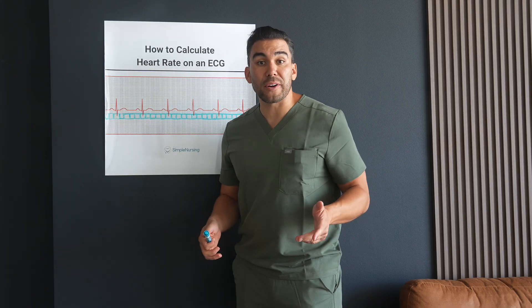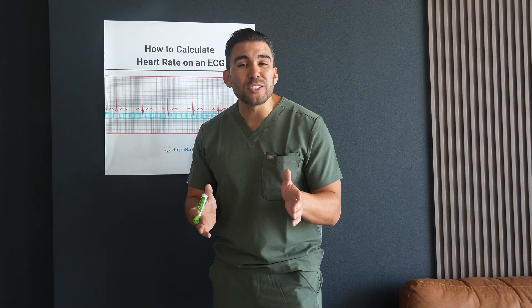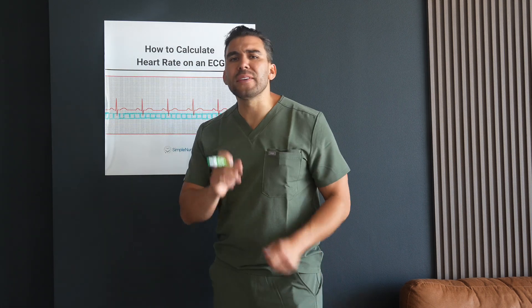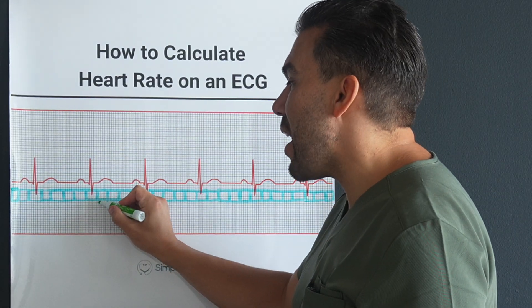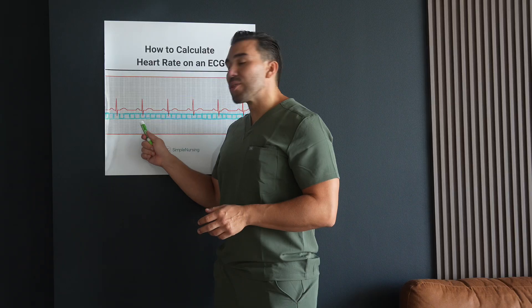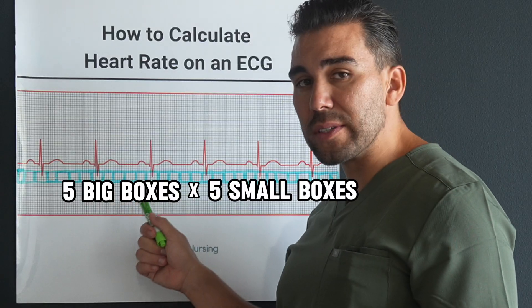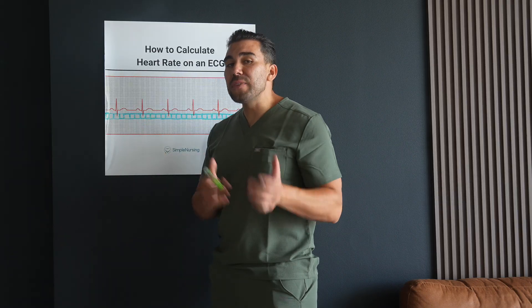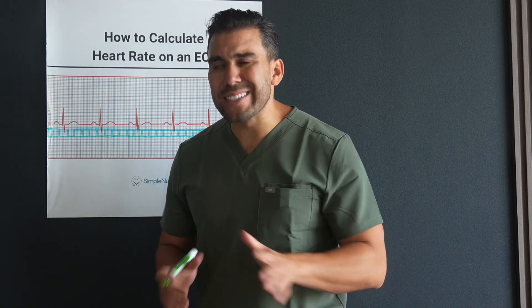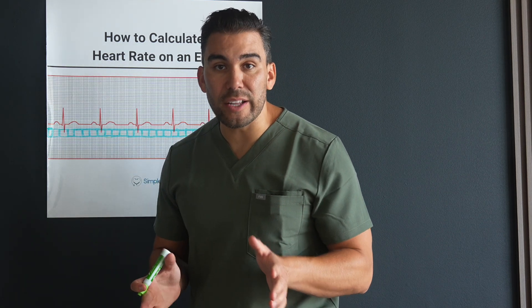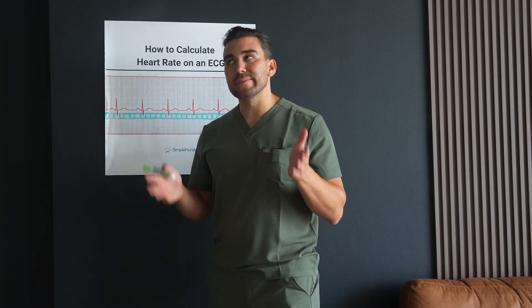For additional methods, let's look at the small square method, which is used for fast rhythms. Simply count the small squares between the R waves and divide 1,500 by that number. For example, inside one big blue box there are five small squares, and five big boxes times five small boxes each equals 25. So 1,500 divided by 25 is 60. This is a poor example since it's not a fast heart rate — it's borderline bradycardia — but technically on the NCLEX and nursing exams, it's normal.